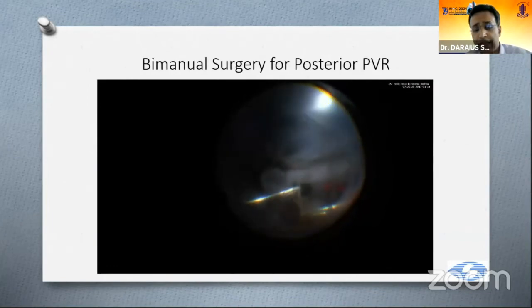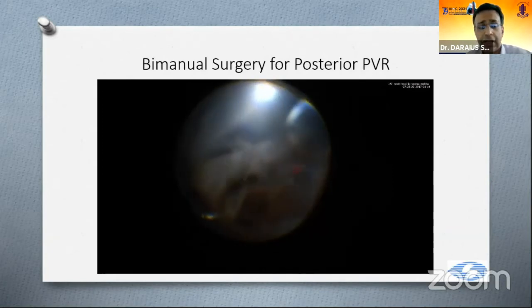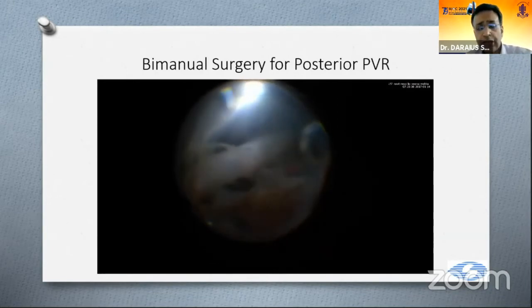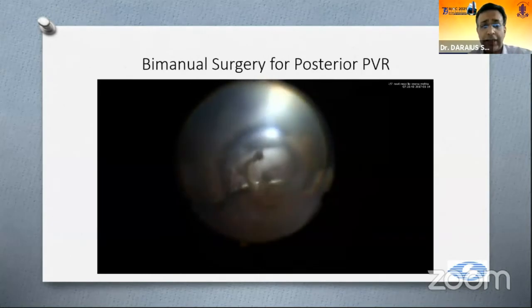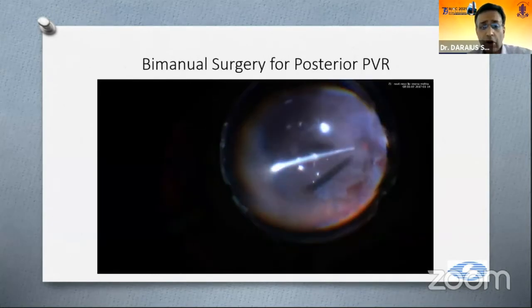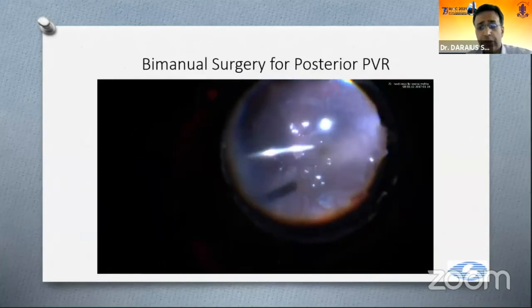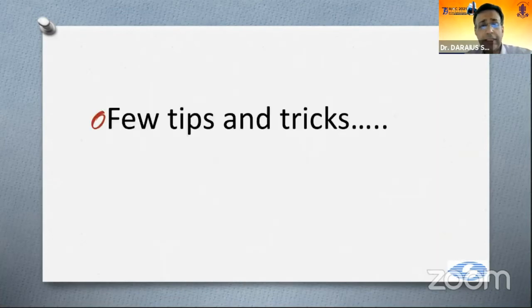And as you will keep seeing in this video, it's not just a single band. It seems to have a lot of tentacles, and removing it is quite a challenge. So fortunately, without resorting to a very large retinectomy or anything like a 180, just by removing this band, which you can see is now floating around with its tentacles, this helped to settle the retina, and now we're doing laser and feeling much better about it. So I think that's the end of this case.